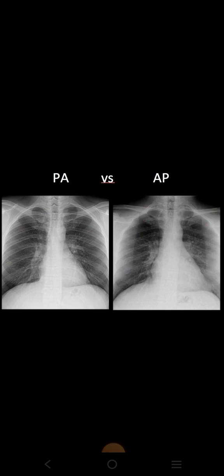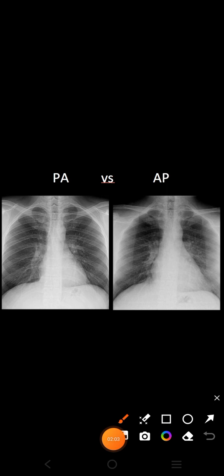Number four thing is that you have to see these ribs. In AP view, the ribs are more parallel in position as compared to PA view, where the ribs are more oblique in position. So these were the things that you can use to differentiate between the AP view and PA view.